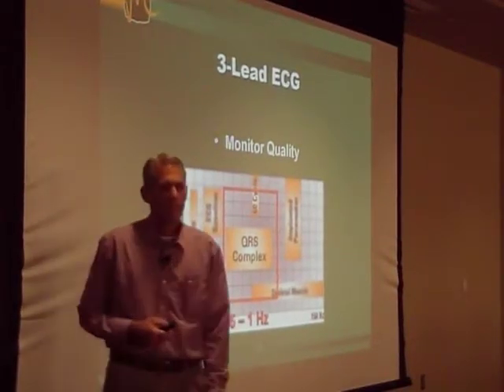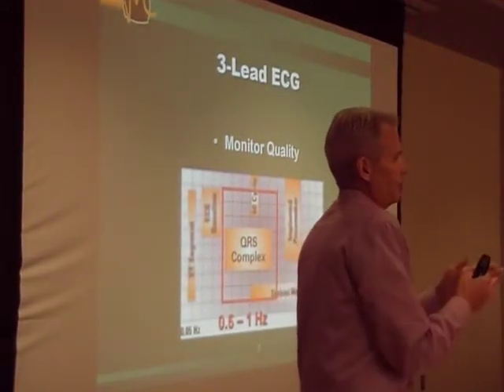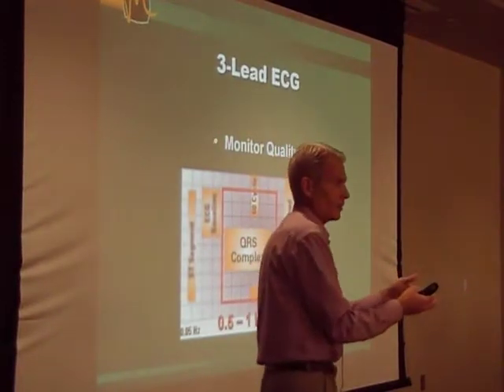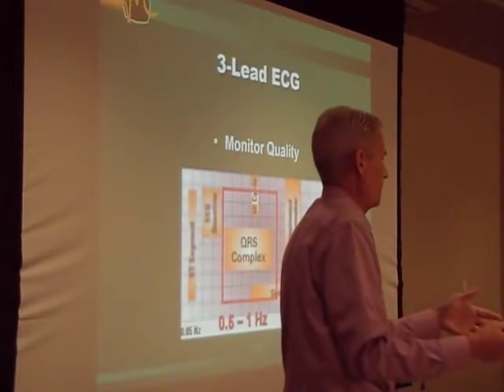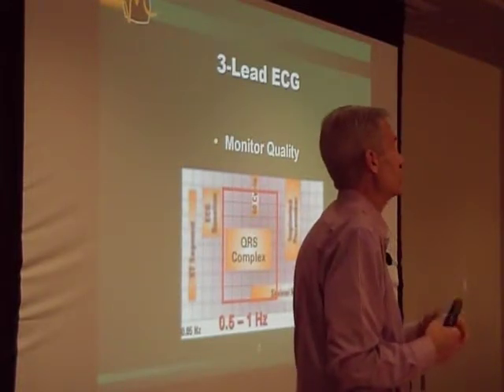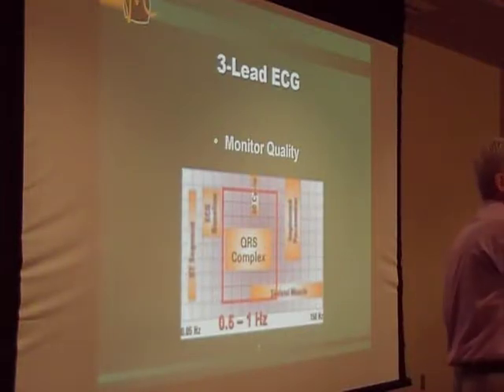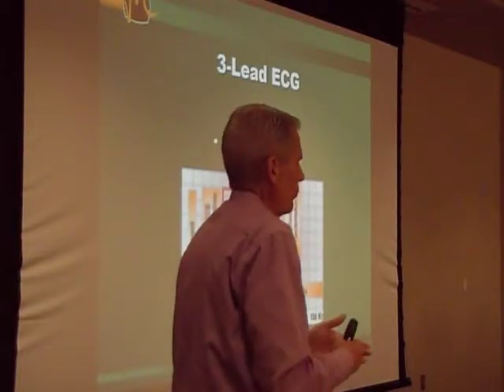Okay? Now, why do I care about all this? When you hit the 12-lead button on your device, the frequency window is changed for you. The reason I'm bringing this up is, especially for my EMS colleagues, depending on what device you're using, when you're going out and doing your 4-limb lead monitoring, when you hit the print button, do you know what frequency your device is set up for? It's worth checking, because if you're trying to do ST segment evaluation while not doing a 12-lead, just doing a lead two interpretation, you can't do it because it's not in the right mode. So you have to know what you have before you know where you can go.